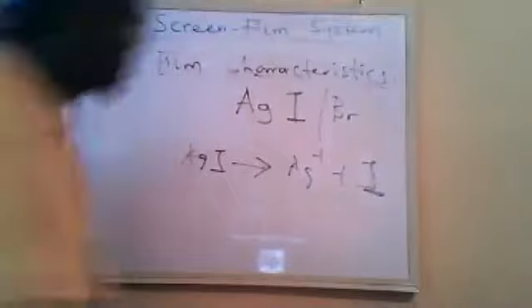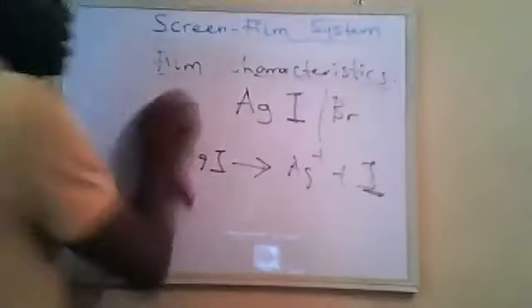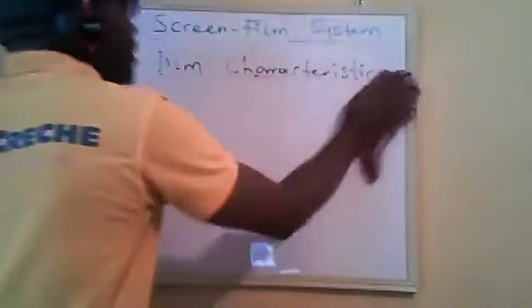We have a very important term I have been using for a very long time, optical density, OD.